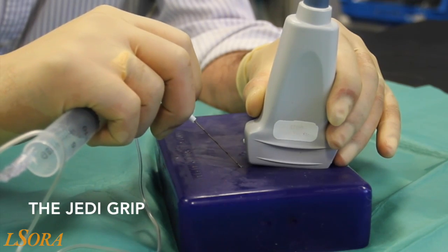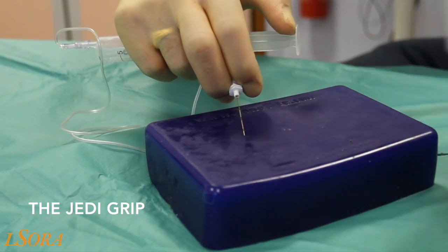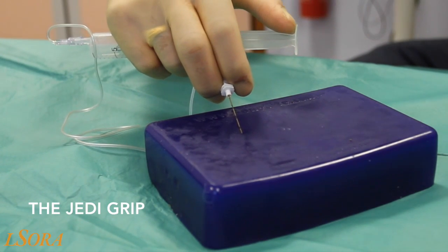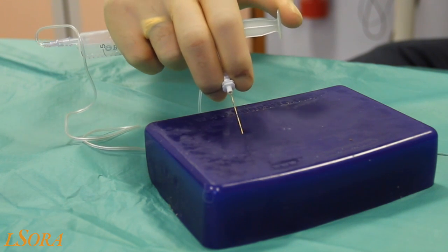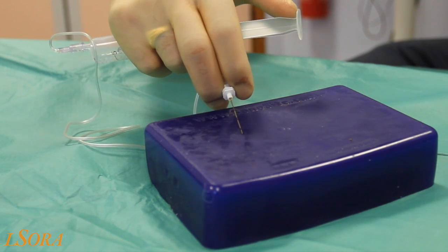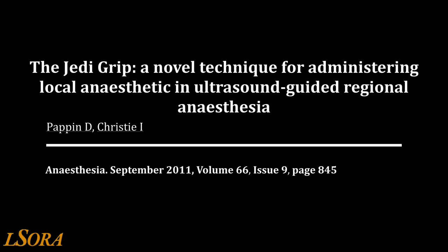The Jedi grip is now demonstrated on a phantom. The needle is inserted with the probe in situ, but this has been removed for clarity. Aspiration and injection using the thumb on the plunger is demonstrated, as is variation in needle tip angulation. The reference for the Jedi technique is shown here.